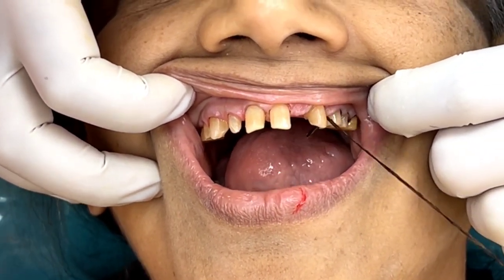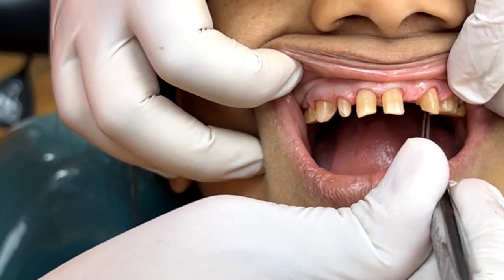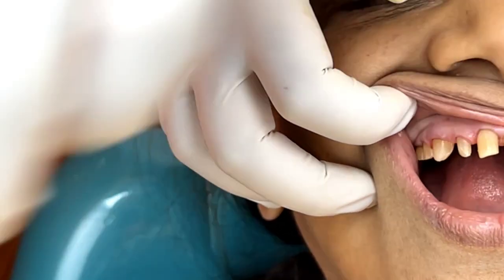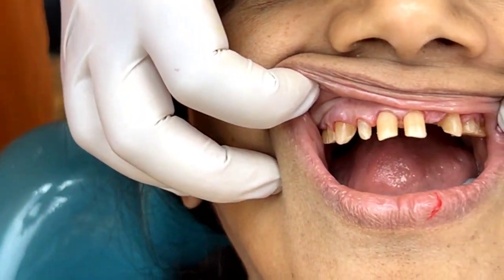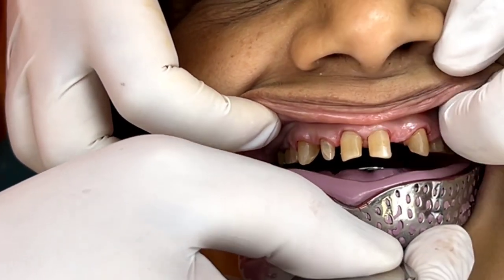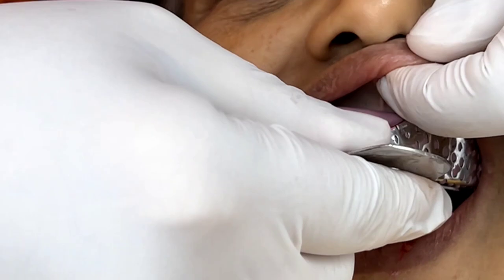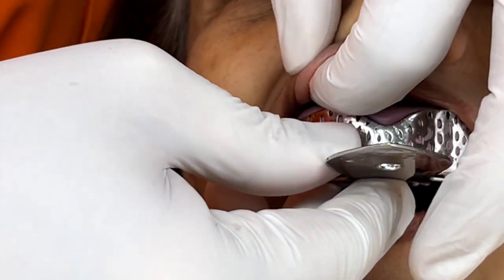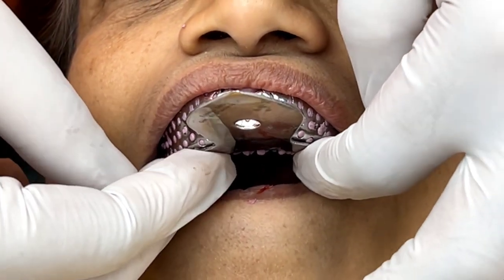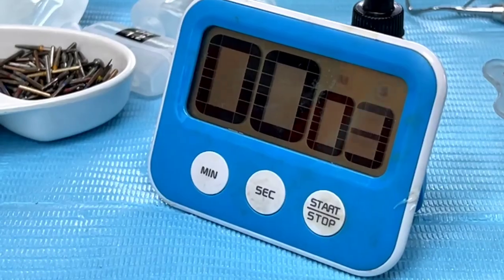Any cord placed inside the oral cavity is removed, and the putty-loaded tray is then very gently seated. It helps to tease the tray into position, as you see me do — very gently tease it in position and slowly seat it.